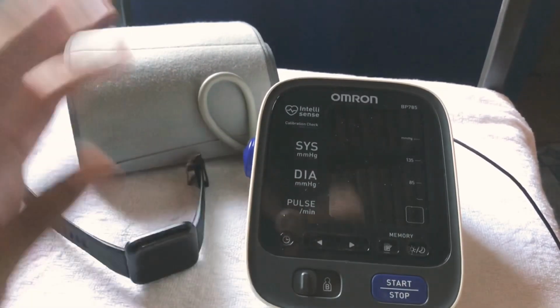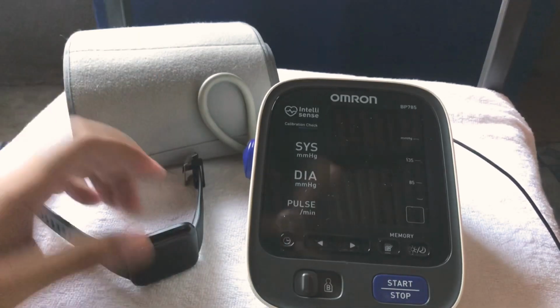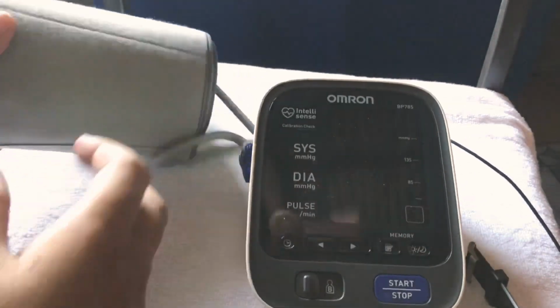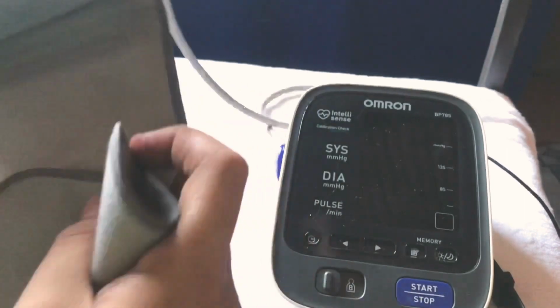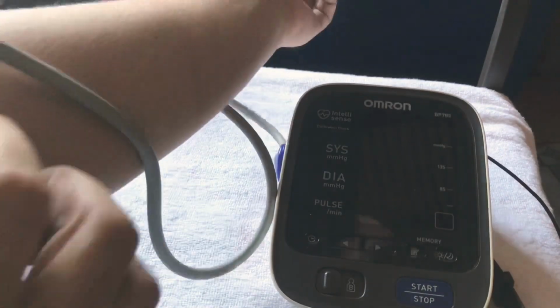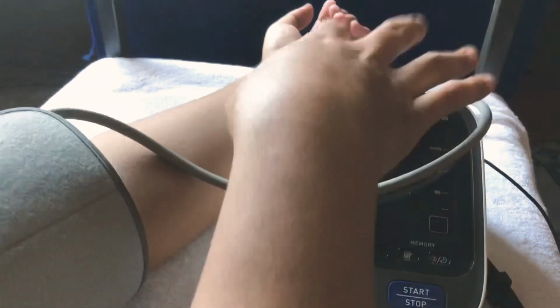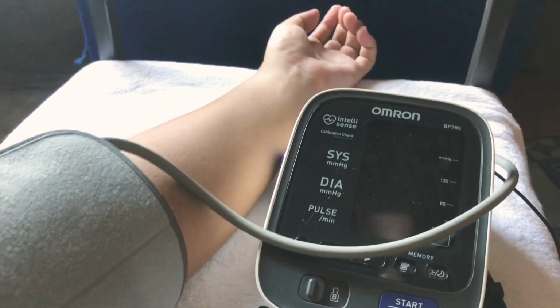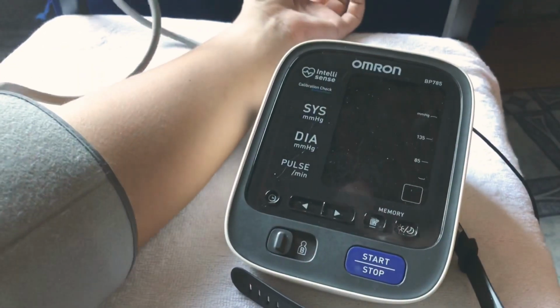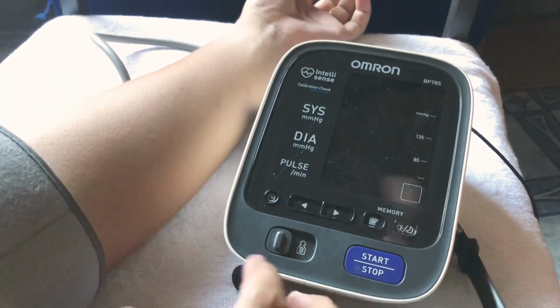Alright, so I always recommend you to choose a real blood pressure kit such as the Omron and other blood pressure devices. So now I have here the Omron device, and let's just start first. So I'm going to get the cuff and put my arm in. Right, so I already rested for 5 minutes, and I'm ready to check my blood pressure. Okay, so I already connected this one to the plug. So let's try to know what my blood pressure is. Okay, so let's start, guys.